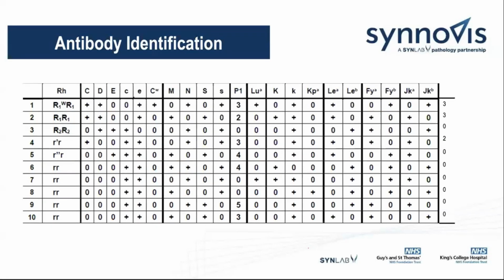I've got an example panel here just to go through with you and to show you how I would work out an antibody investigation. I have scored my cards, which you can see on the right-hand side. I've got my reactions present, and this shows me that there were positive reactions detected in these wells. If the antigen is present, it should be positive for these wells.